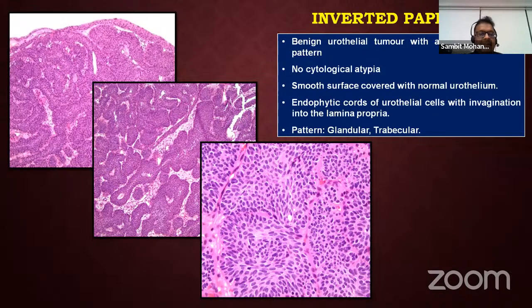Okay, so streaming and palisading are used very, very interchangeably among all of us in the GU community. It is unlike the people who do skin cancers, like basal cell carcinoma and all. We use streaming and palisading more interchangeably and more in a synonymous way.